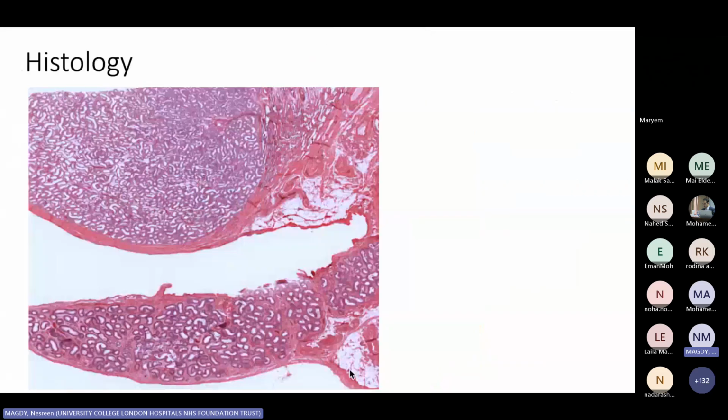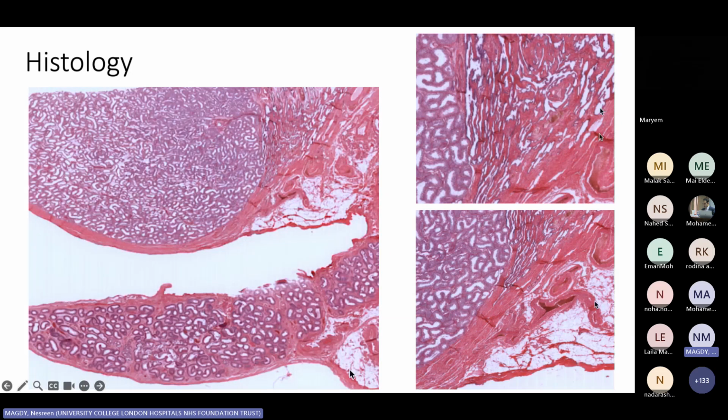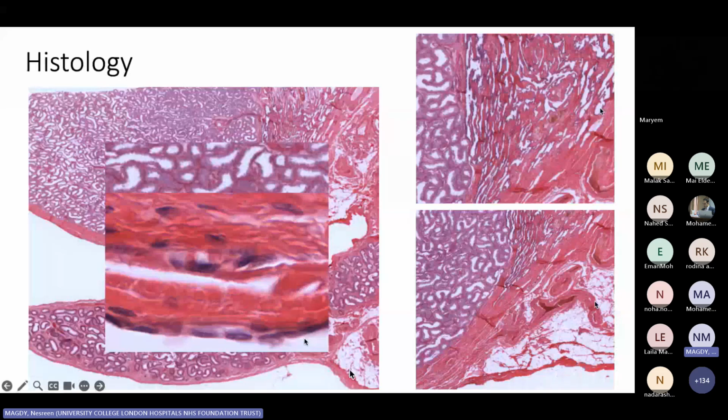On the histology level, this is the normal testis, and this is the fibrous tunica albuginea, and this is the adjacent epididymal head. This is the testicular hilum, which shows these ramifying, arborizing spaces, which are the rete testis emerging out of the testis towards the epididymis. And this is the adjacent hilar soft tissue that contains fat and blood vessels. This is the fibrous tunica albuginea, and this is the single layer of mesothelium of the visceral tunica vaginalis.